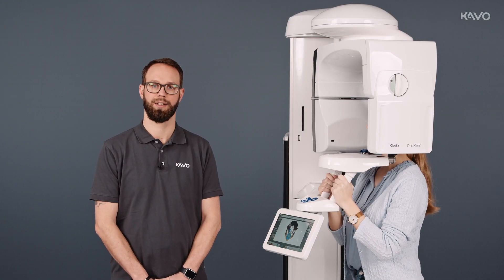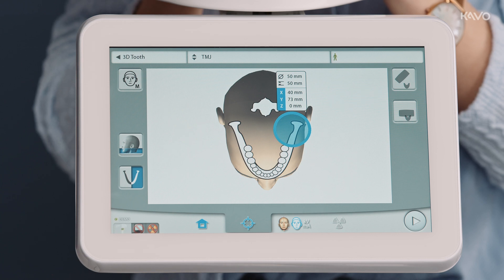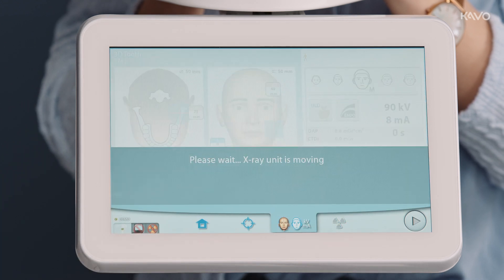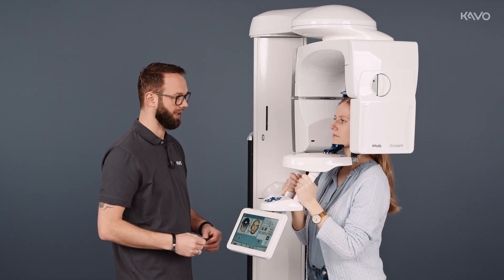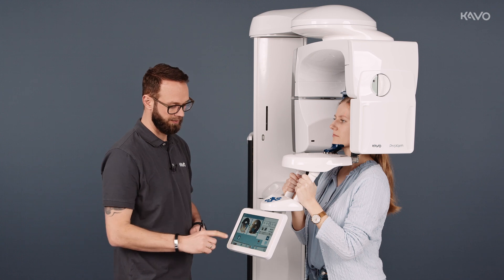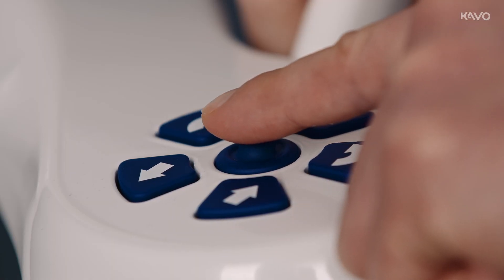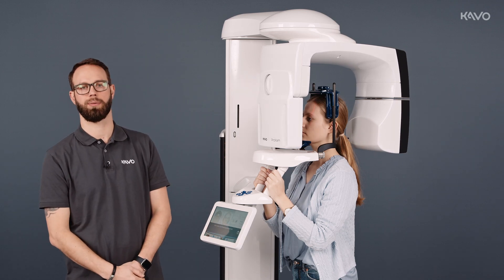We can perform temporomandibular joint imaging with the ProXM 3D with both small and large volumes. Now we'll demonstrate it with the small volume. To do this, we go to the temporomandibular joint section on the display, set the upper jaw positioning, and go to the patient positioning level. Here too, we can use the joystick to target the laser aimer at the temporomandibular joints. Make sure that we still have our 3 cm radiation-free area. Go to the 90-degrees section to aim at the temporomandibular joint from the side as well — we use our joystick again for this. Once we have successfully targeted the temporomandibular joint, we can go into image ready mode on the display and start the volume.